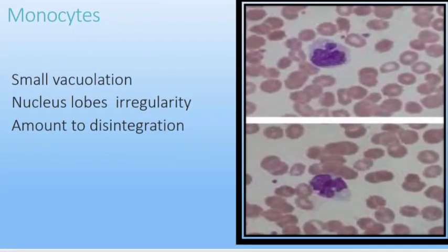In monocytes, we can observe marked changes. Small vacuoles appear in the cytoplasm, and the nucleus undergoes irregular lobulation which may almost amount to disintegration.